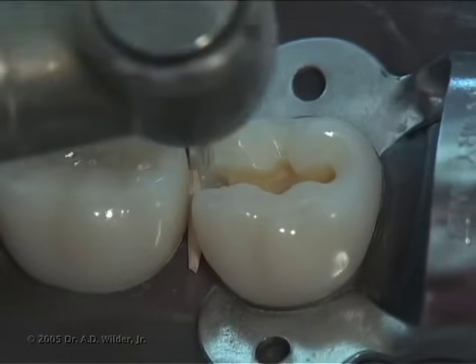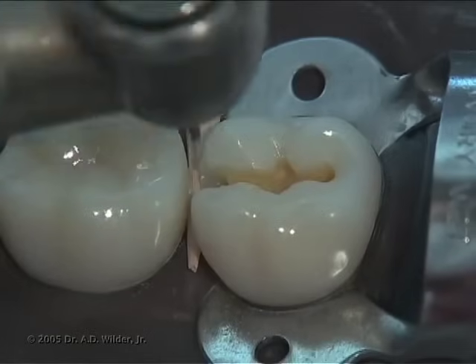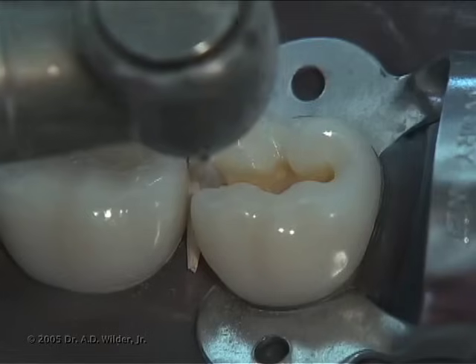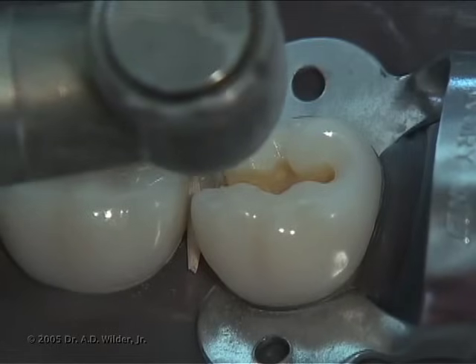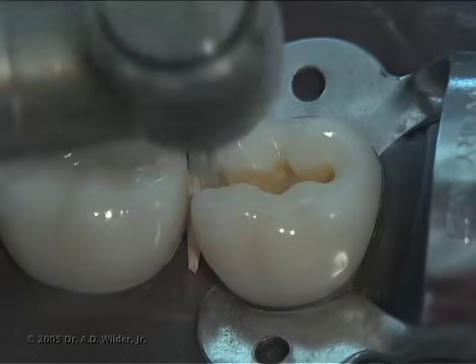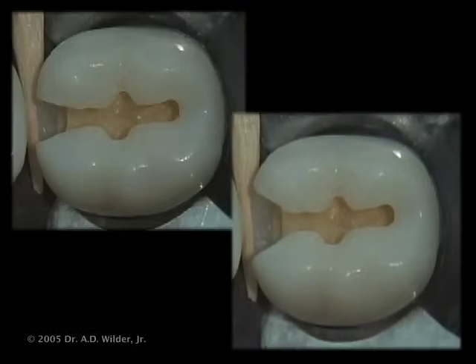We also want the facial and lingual walls to exit from the proximal tooth surface at 90 degree angles. That is, a 90 degree angle should be formed between the wall and the natural tooth surface. Here you can see that the exit angles in the second preparation are closer to the ideal 90 degrees than the first.